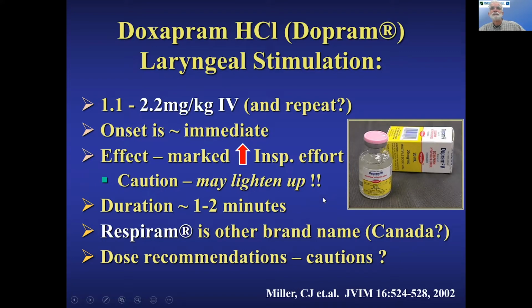And you have to be careful here. Anticipate that they may lighten from almost any anesthetic you've used as they start to lighten up. So have that propofol handy or whatever you're using to be able to titrate a little bit higher. It'll last for a couple of minutes. Side effects may be changes in heart rate or blood pressure. They're transient. You may feel, if you hold on to their skull, a little fasciculation on occasion. I don't feel that very often. Of the skull musculature. In Canada, I was told that Dopram, doxapram isn't available. Respiram is another manufacturer's name that I think is available in Canada. You might be able to get it that way.